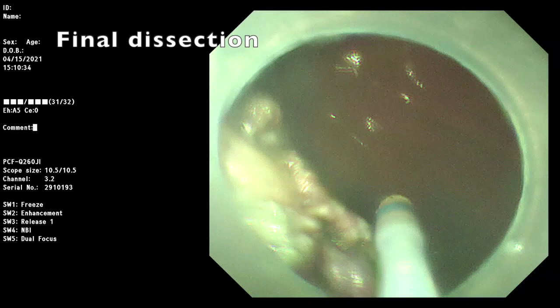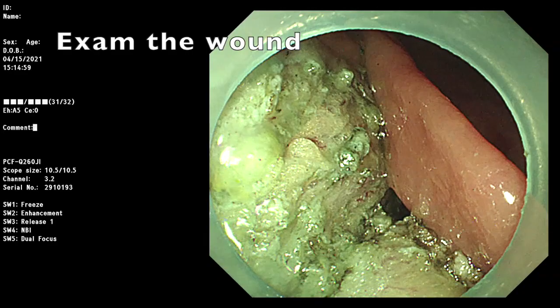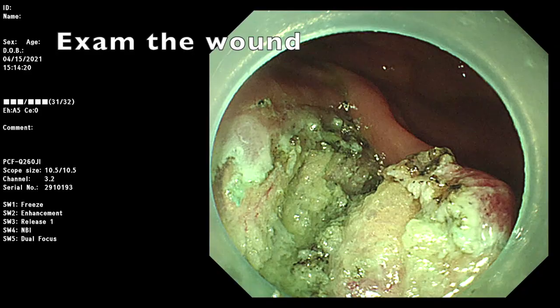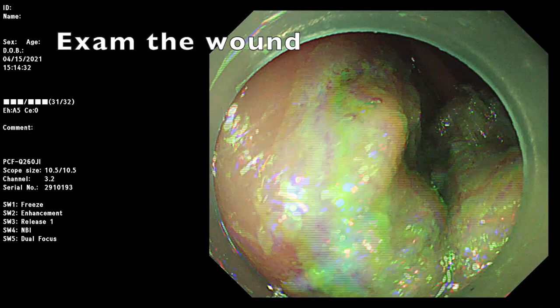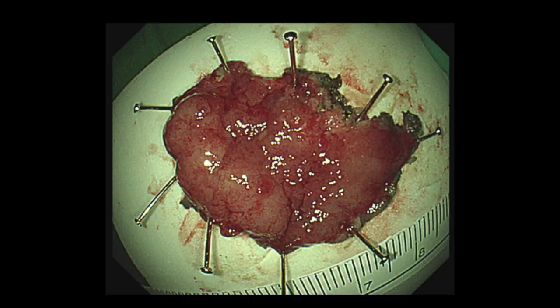This is the final dissection. Here we examine the wound to make sure there is no bleeding or perforation during the whole procedure. Procedure time is 90 minutes and pathology review confirmed tubular adenoma with low-grade dysplasia.